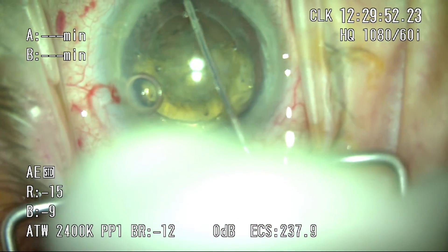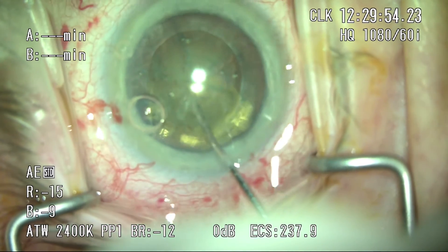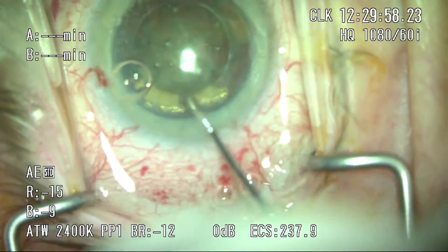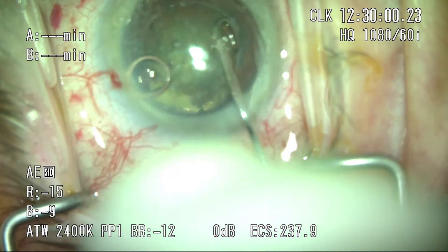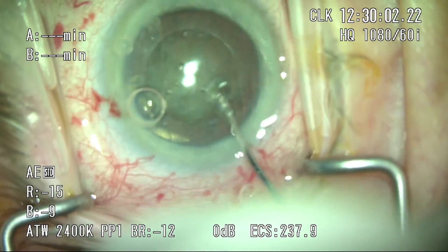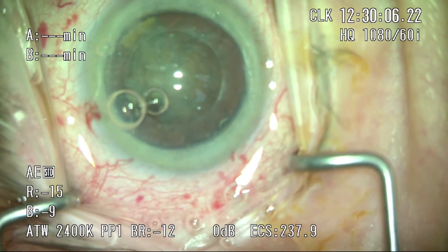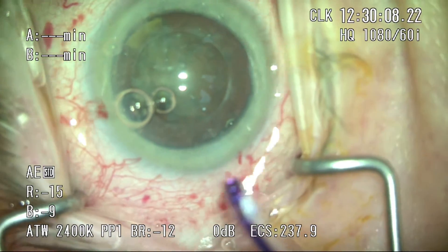On further cases beyond this, I've learned that I can proceed with a regular hydrodissection and just strategically push down and blot the lens in the area where there are bubbles — they do come forward quite easily. Here, you can see I've got good rotation of the lens and those bubbles have completely come up into the anterior chamber and we can proceed with phaco.